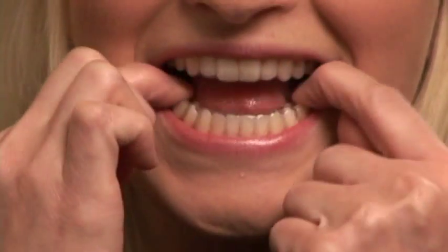Whenever I feel like my teeth have moved, I just pop my Vivera retainer in and it's comforting. I know it's pushing my teeth back into the place that they should be in, and it helps me maintain my smile.